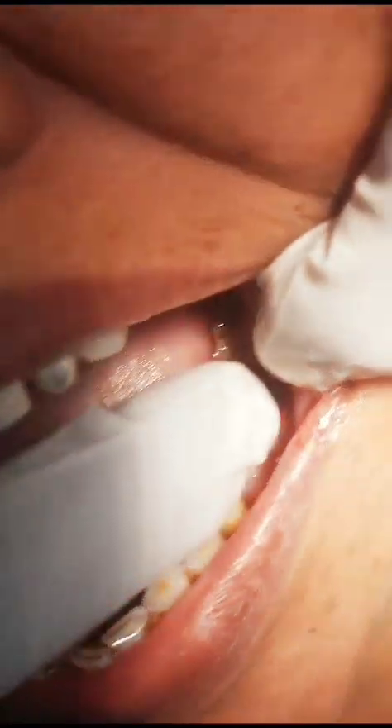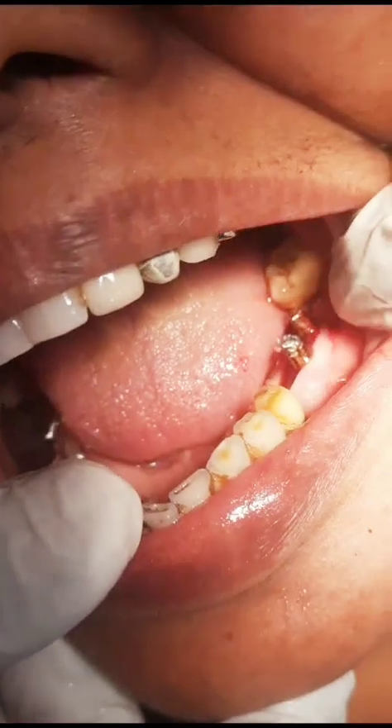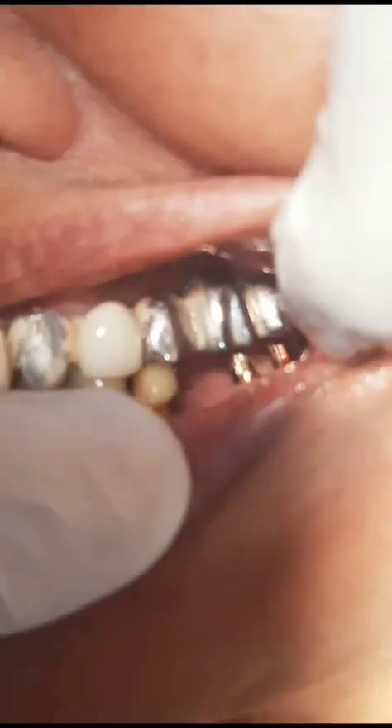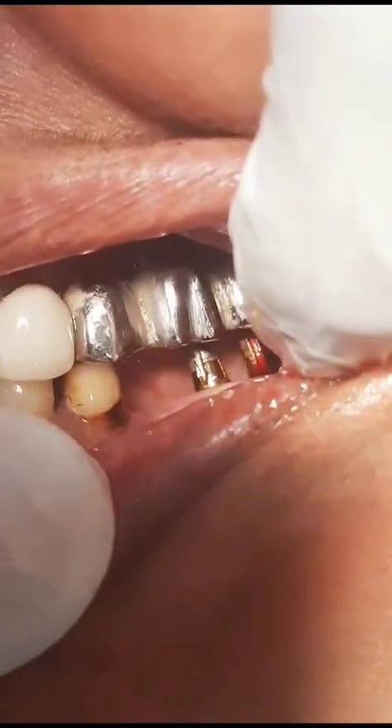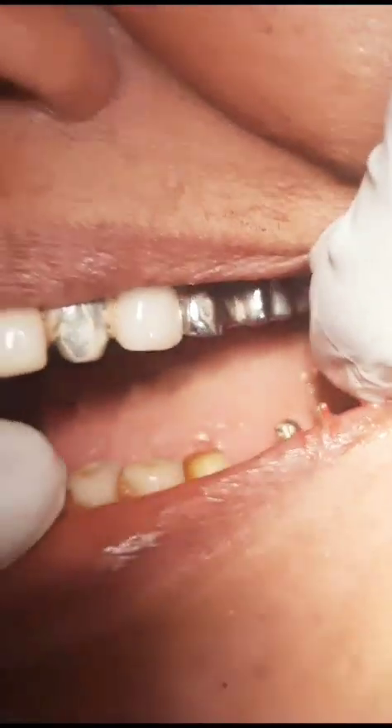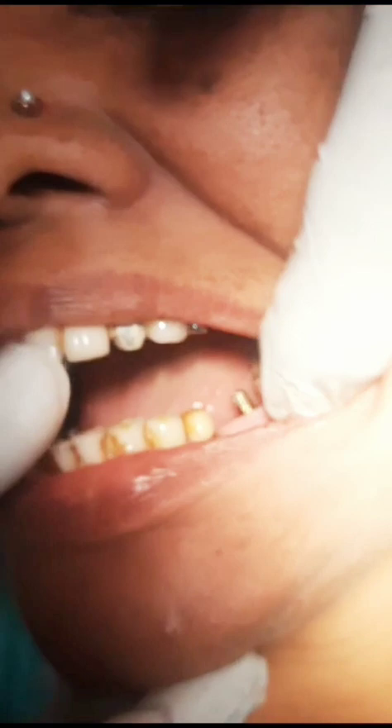The implants are very, very stable. You can see that even when I am trying to move them, the patient shakes — the anchorage in the cortical bone is very good. There is also very good clearance in the occlusion. You can see there is a 2mm clearance here, so I can easily fix the teeth. This tooth is also available for the crown, so totally there will be three teeth here that we are going to fix.